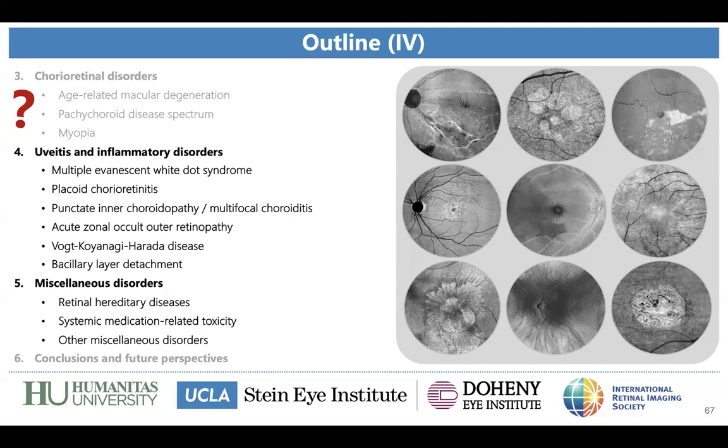So thanks so much, Luis. First of all, I totally agree with your first point. It's true. Dr. Rosenfeld is very, very supportive of this concept of en face OCT for geographic atrophy, and I think he's right. I mean, it's non-invasive, and does not create discomfort to the patient, like FAF can, even though it's non-invasive. And regarding the second point, there are some studies regarding the different choroidal vasculature patterns in CSR.